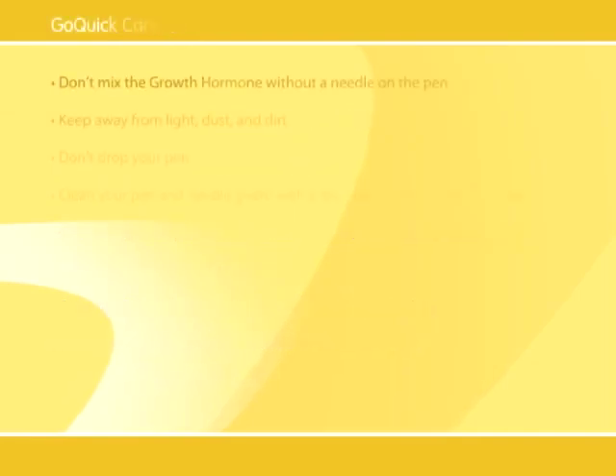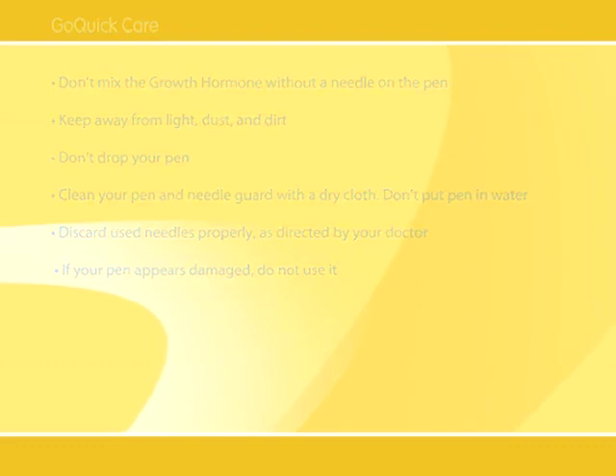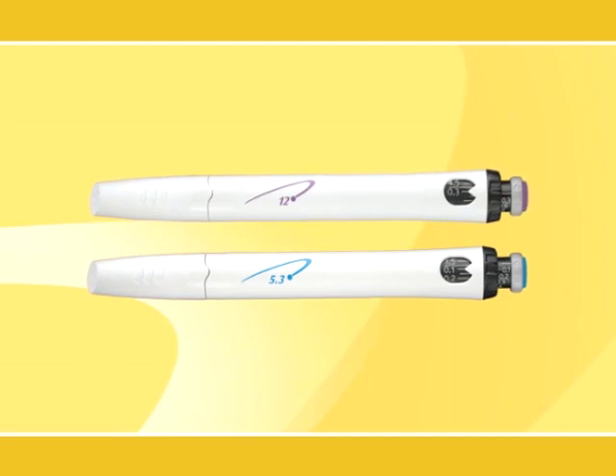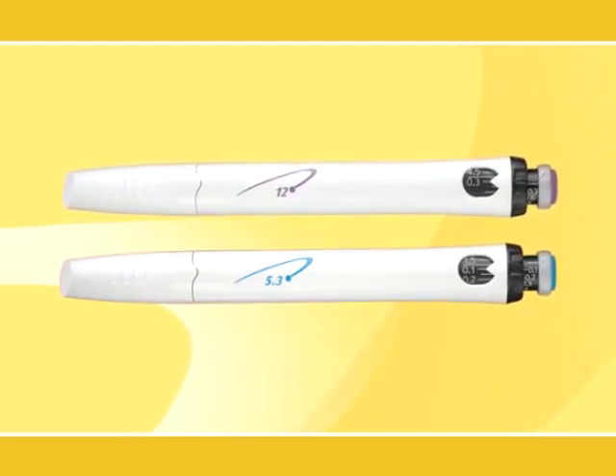When caring for your pen, don't mix the growth hormone without a needle on the pen. Keep your pen away from light, dust, and dirt. Don't drop your pen. Clean your pen and needle guard with a dry cloth, but do not put your pen in water. Follow your doctor's directions to properly discard used needles. If your pen appears damaged, do not use it. It may seem challenging at first, but the more you perform the initial setup and do the three simple daily steps, the more reassured you'll become.